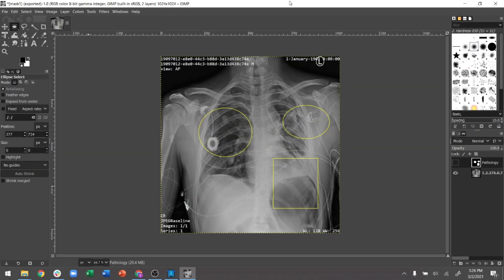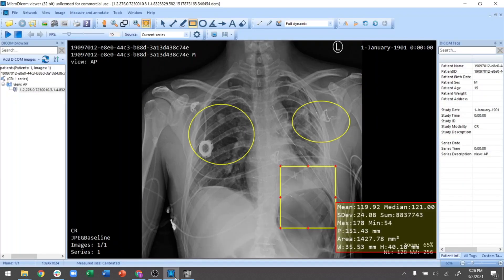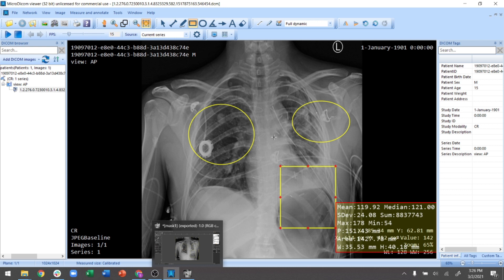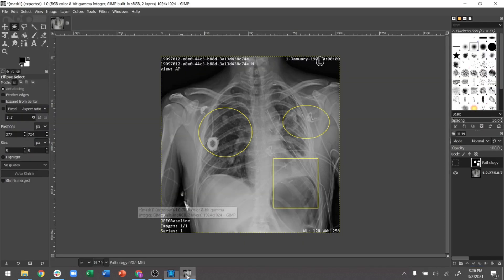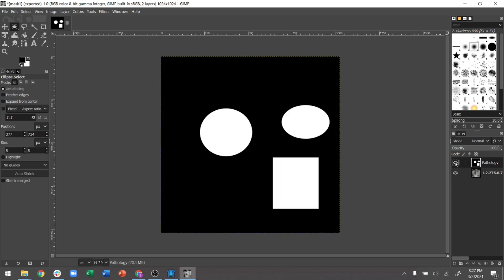If your intention is to get annotated medical image data from DICOM files, I recommend a two-step process. First, use the Micro DICOM viewer to generate annotations from the doctor or specialist and convert images from DICOM to JPEG. Then open the JPEG in GIMP, keep creating new layers, annotate the images, and apply this labeled data for your machine learning algorithm. I hope you find this useful.